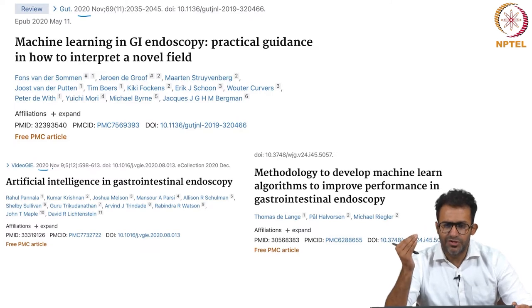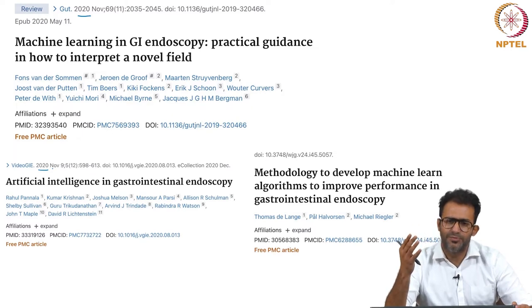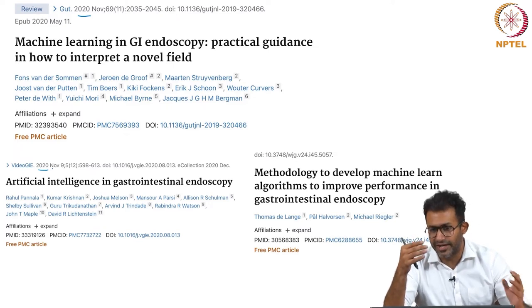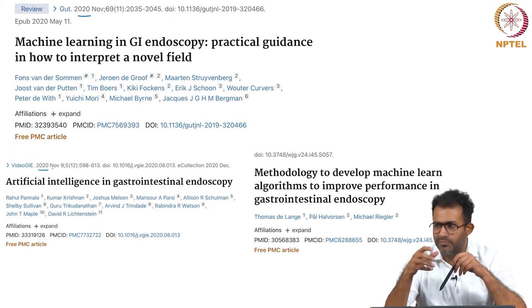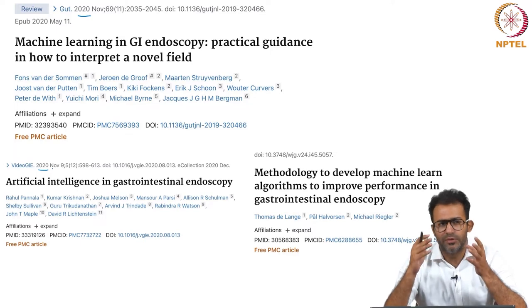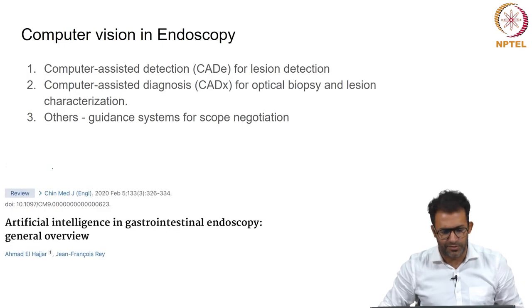One of the major challenges in adoption is that clinicians have not warmed up to the idea of using artificial intelligence for diagnosis. There's still a lot of resistance among clinicians to using artificial intelligence techniques. There's a huge perception of how a machine can understand a diagnosis or a cancer or a particular polyp better than a human. And evidence has been conclusively mounting that machine learning techniques are improving and are proving to be better than clinicians in understanding endoscopy and making endoscopic diagnosis.